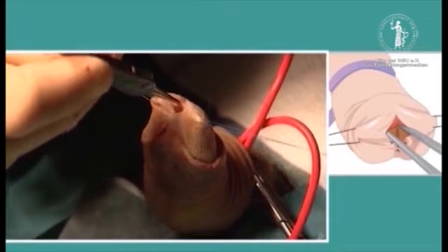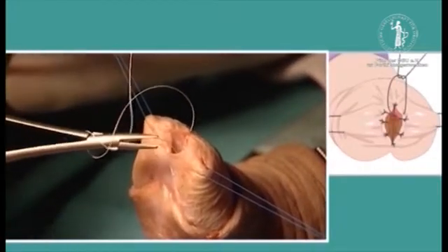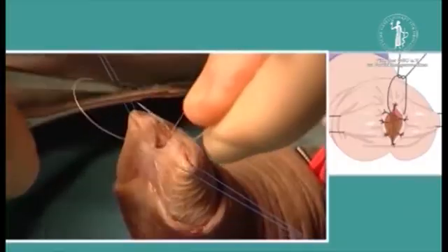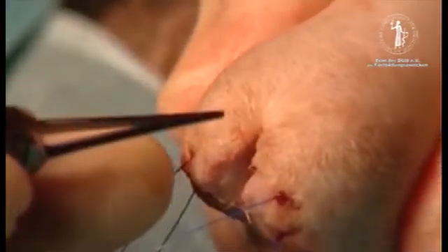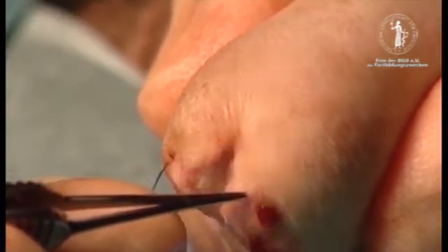Again, the glans and urethral epithelium are apposed with interrupted polyglactin sutures. In this case, we usually use five sutures to get good apposition of the urethra and glans. Although this creates a wide open urethral meatus, it forms an unshapely glans and a kippered end to the penis.